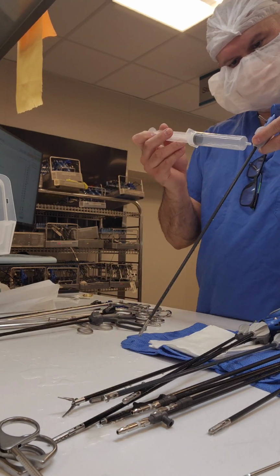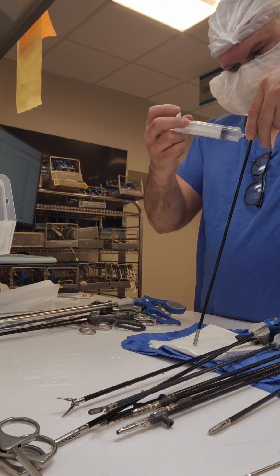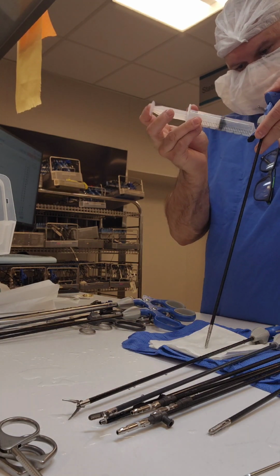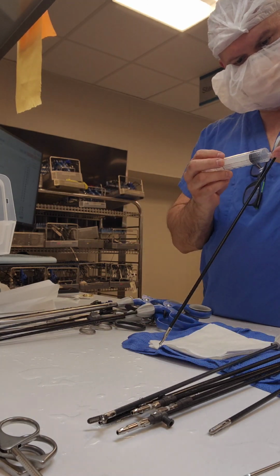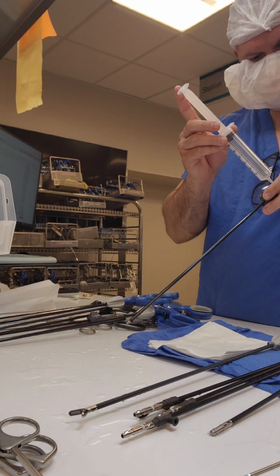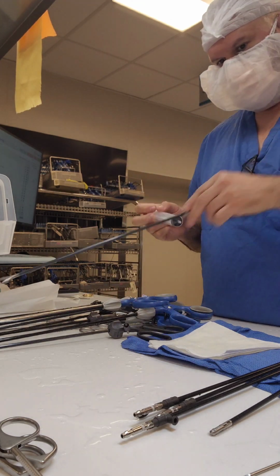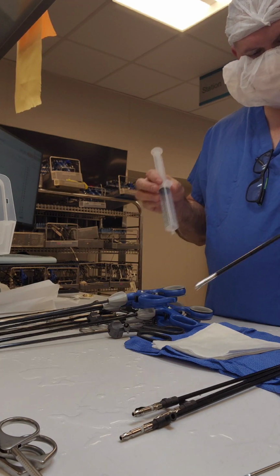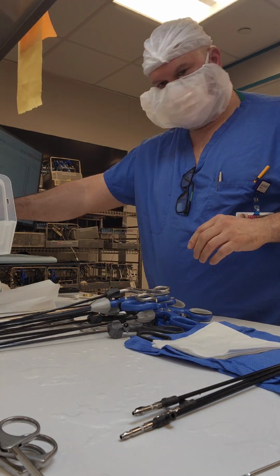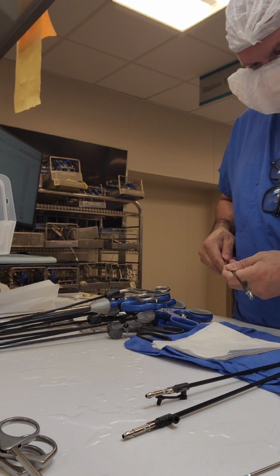At one point, it was actually recommended that you purge your laparoscopic instruments with water to help the steam sterilization process. I actually thought that was a pretty good idea, because it's hard to get steam into these single-unit instruments. Steam is passive, even though it's under pressure, and it is shown by data that with lumen items, it's very difficult for steam to get in there and for that temperature to reach. So having a little bit of moisture in there is not, in my opinion, going to interfere with the sterilization process.